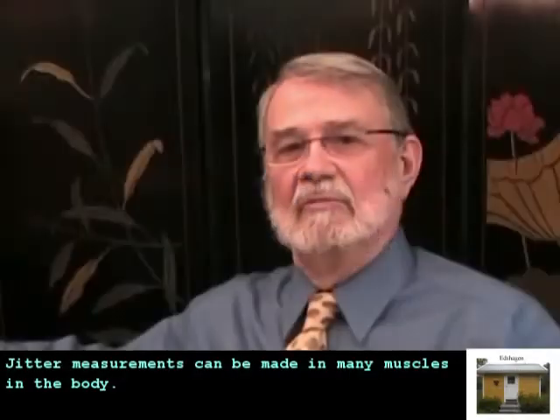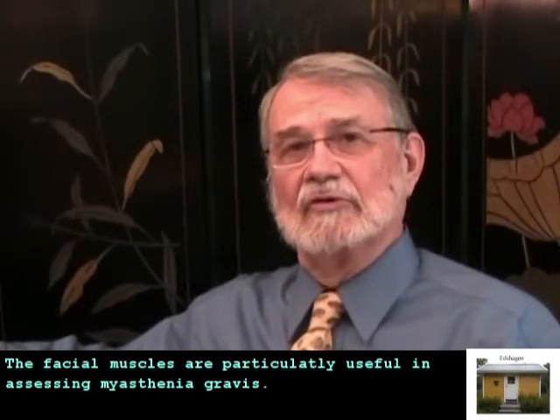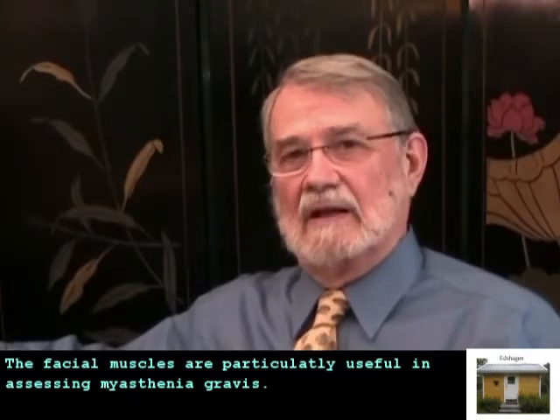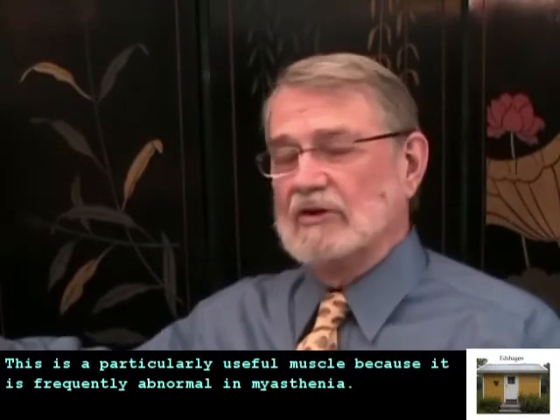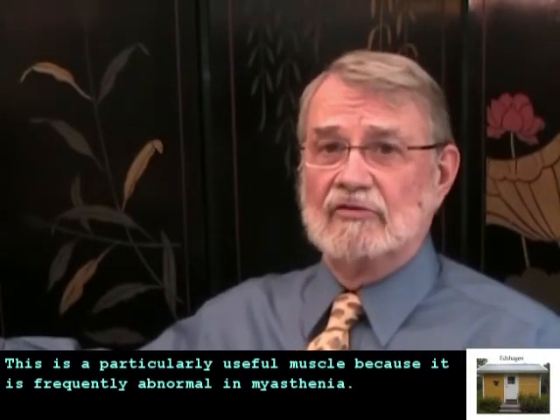Jitter measurements can be made in many muscles in the body. The facial muscles are particularly useful in assessing myasthenia gravis. We're going to do jitter measurements during voluntary activation in the frontalis muscle. This is a particularly useful muscle because it's frequently abnormal in myasthenia.